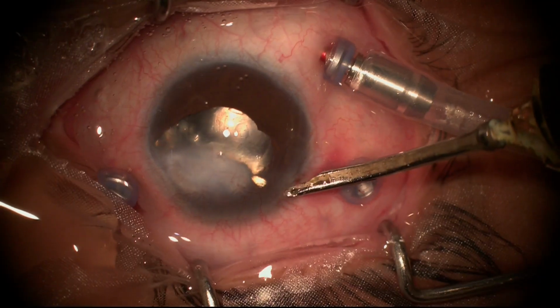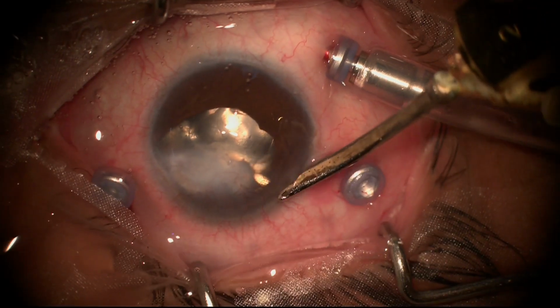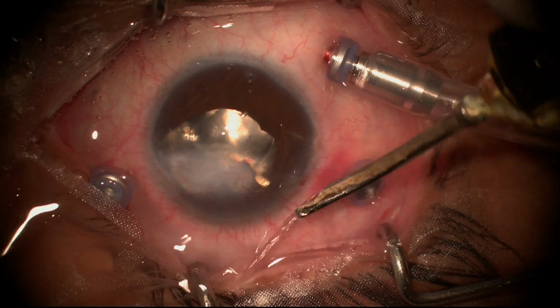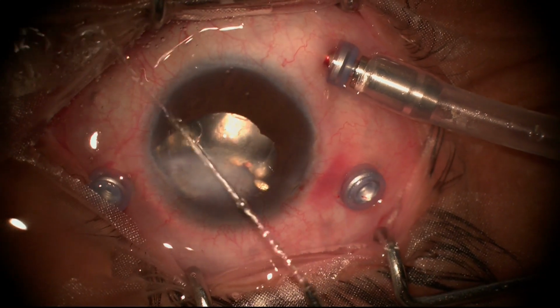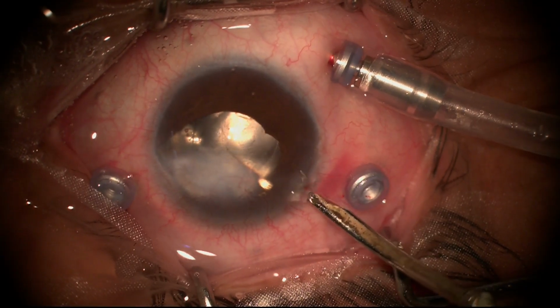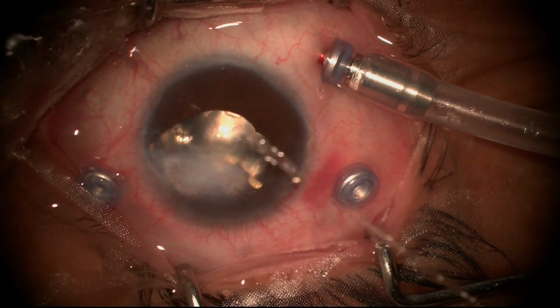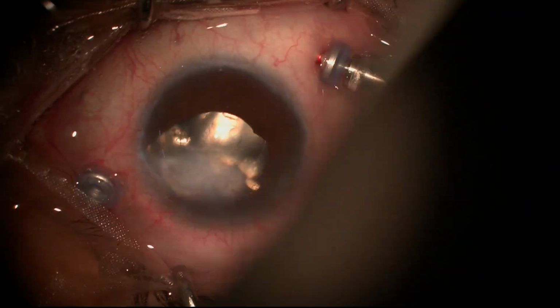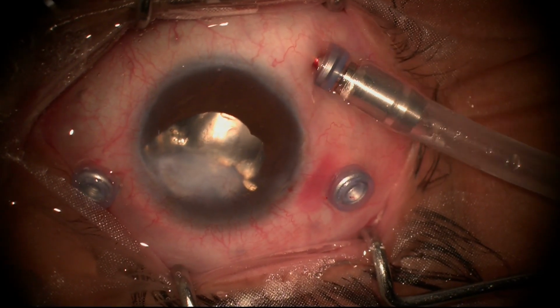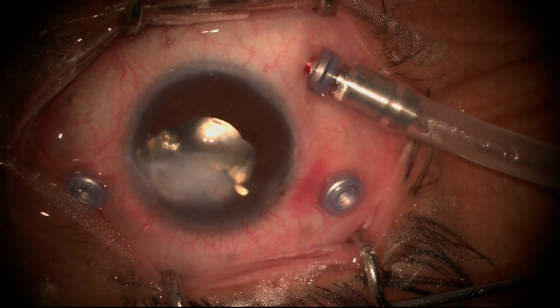Either I enlarge this or I open up that incision, or I leave behind some visco and not bother about it. I don't want to enlarge it. There's a reason for that also. If I enlarge this too much and it becomes incompetent, then when we are putting in oil, the anterior chamber may leak, and then you will have oil migrating into the anterior chamber. It displaces the IOL.